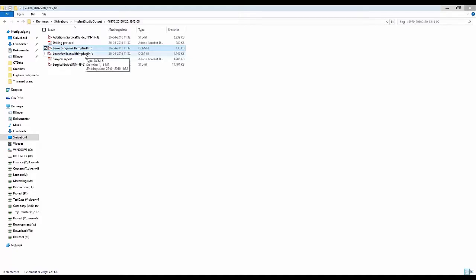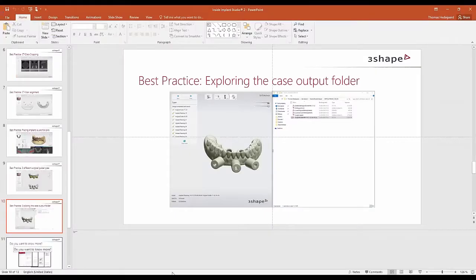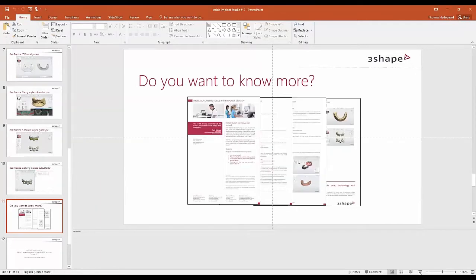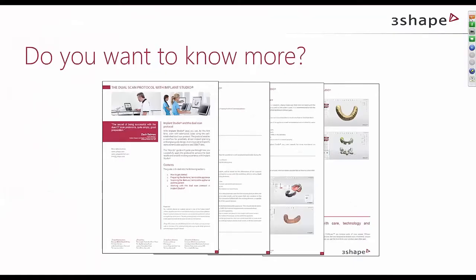Yeah. So it's all along also our story about guided prosthetics. It's more than surgical guide software we are offering to the market. It's about enabling guided prosthetics from the start till the end, all planned through. All of this, what you just learned during the last two webinars, is also summarized in our how to run the dual scan protocol document, which we will send once again after the webinar to you, plus a recording. It's also uploaded to the handouts section of this webinar, so you should be able to download it.